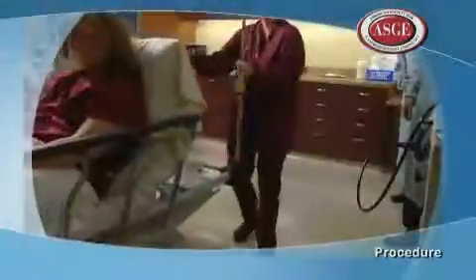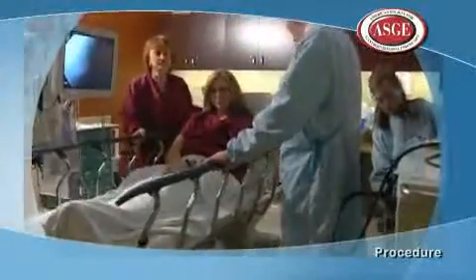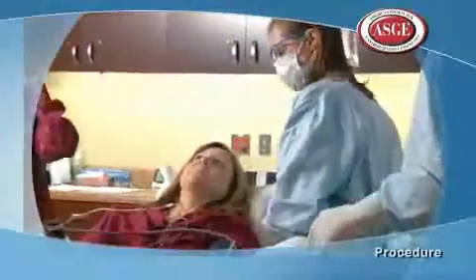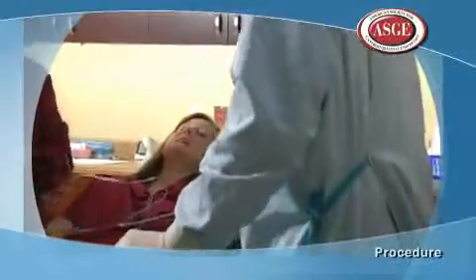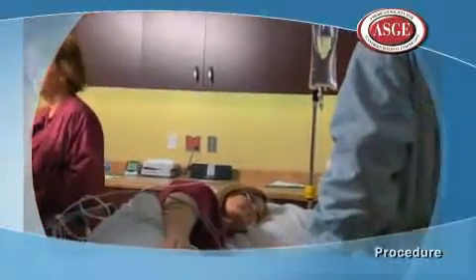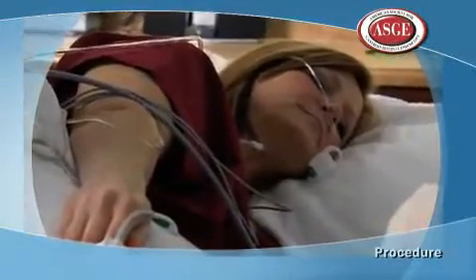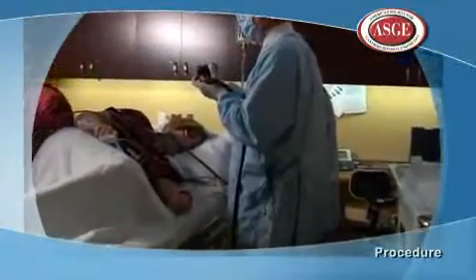Upper endoscopy is performed in a procedure room equipped with an endoscope and TV screen that shows your doctor the images from inside the upper GI tract. Before the exam, you will have a needle placed into a vein in your arm in order to give you the sedation to make you sleepy, as well as other medications you might need. This will keep you comfortable throughout the procedure. Again, many patients may fall asleep completely and may not remember anything about the exam.